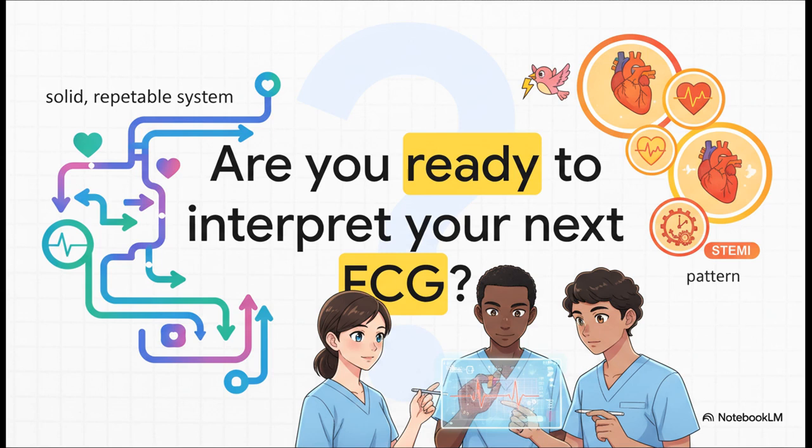So there you have it, a solid, repeatable system. You've got the high-yield patterns, you've got the mnemonics, everything you need. So the next time a resident hands you an ECG on your ward round, or you see one pop up on your exam, you're not going to panic. You're going to know exactly what to do, step by step.